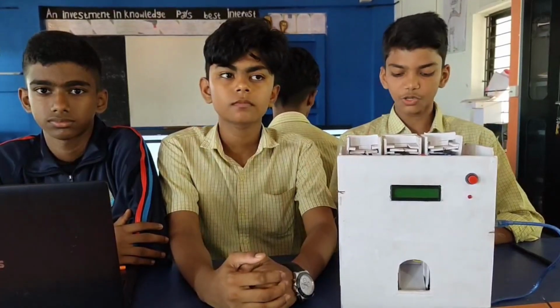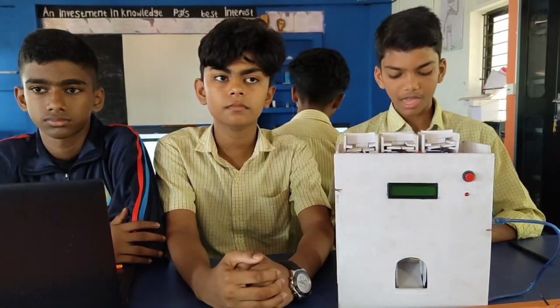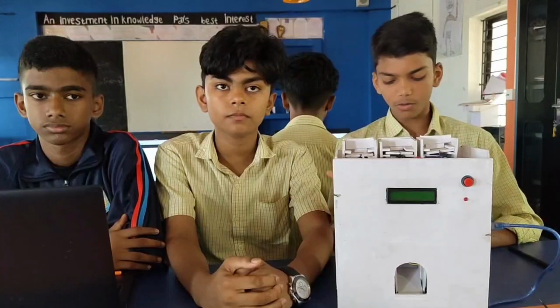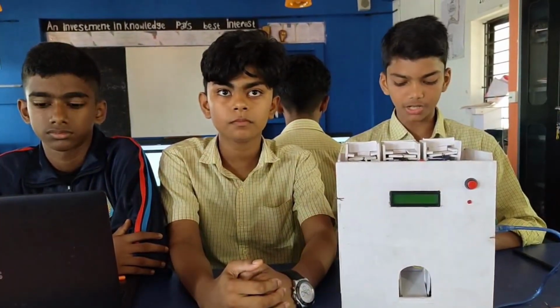An RTC module is used as a clock, so the device stays in right time even when the device is switched off. LED and 3 servo motors which push down the medicine, and a push button and the buzzer are used in the alarm.